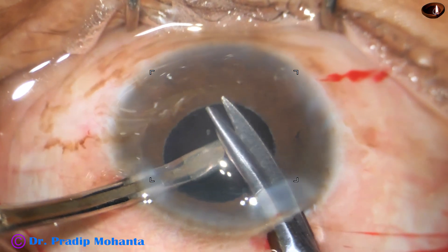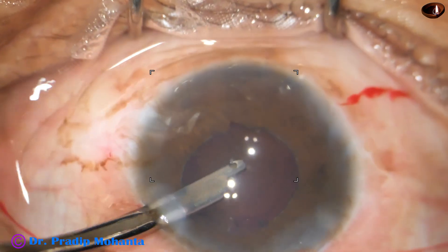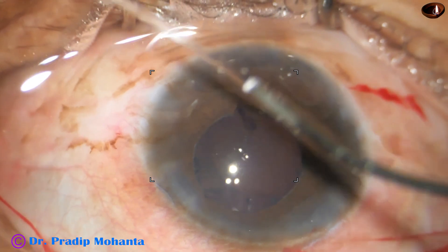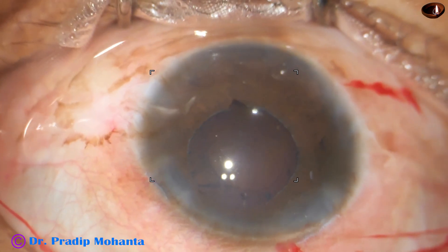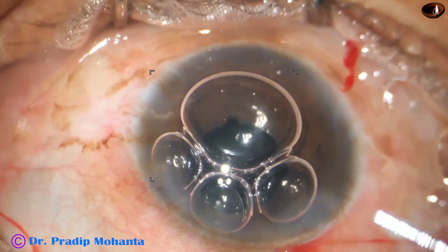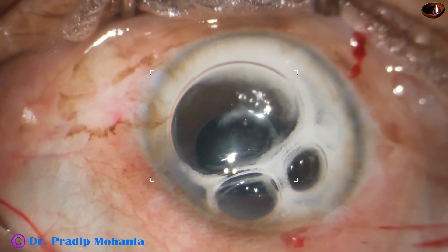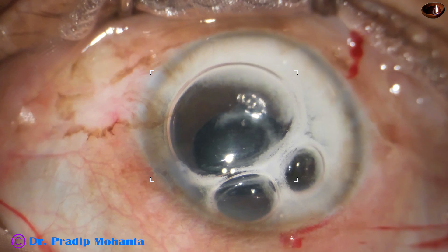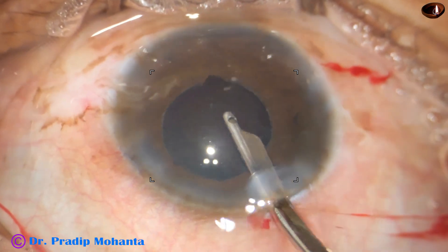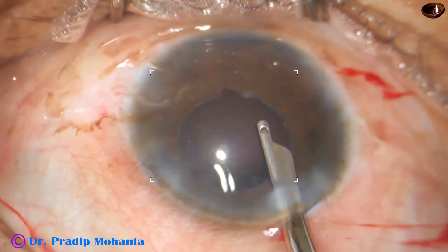A small sphincterotomy is performed so that the retina can be visualized well whenever we want to assess it. The pupil was very small, so I just made a small cut at the pupillary margin. I injected some triamcinolone acetonide to see if there are any vitreous strands in the anterior chamber — but I was sure there were none. And now we are towards the end of this surgery.